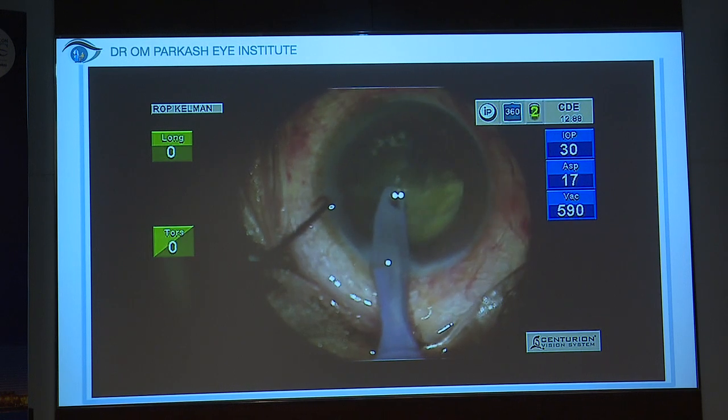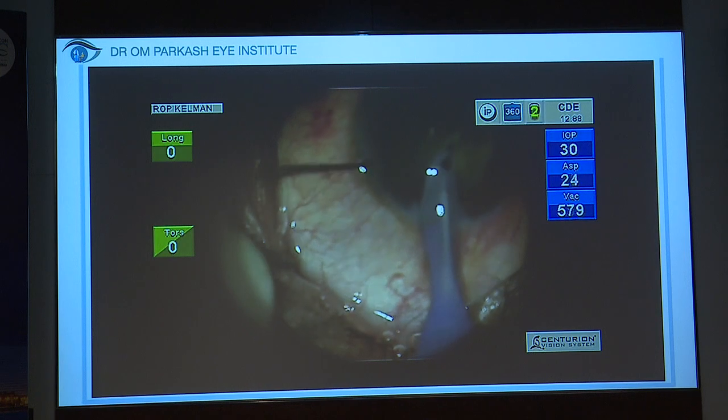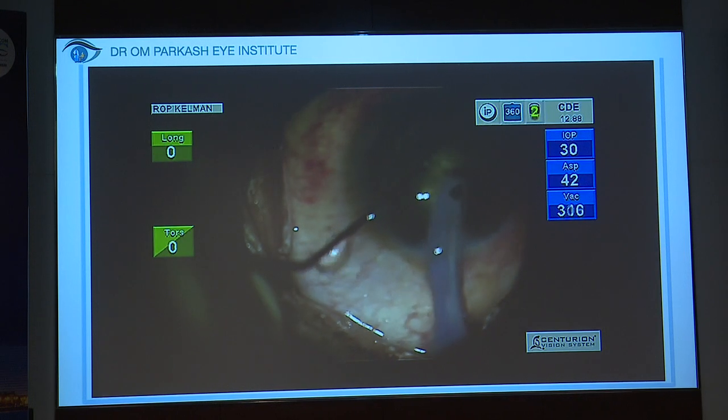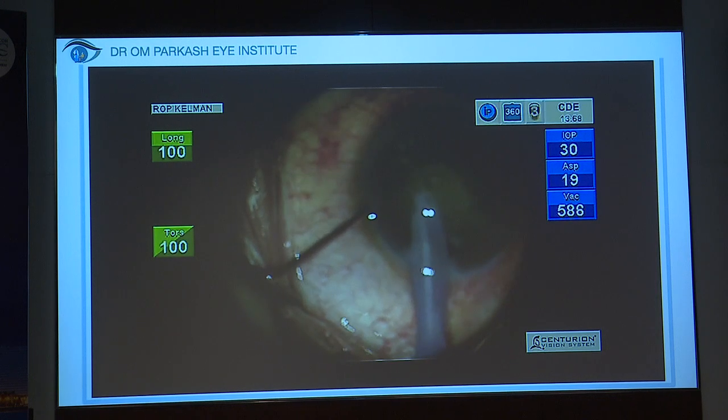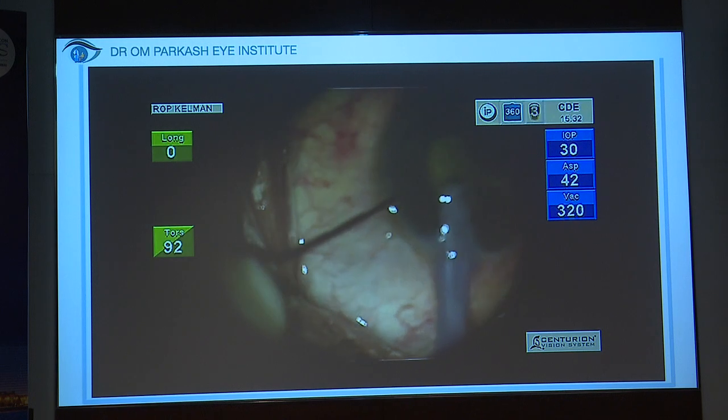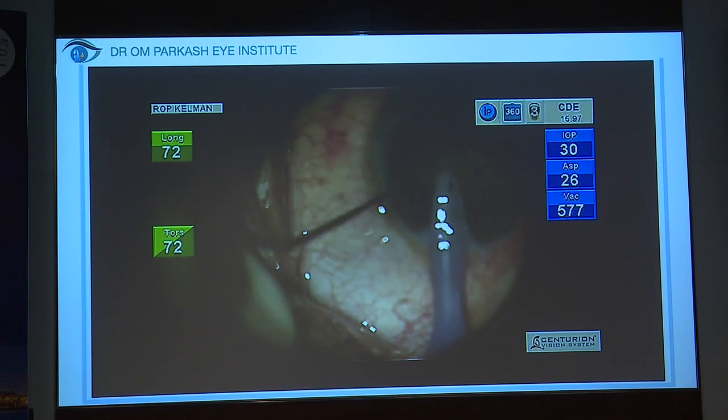So slow motion phacoemulsification should be done, avoiding any nuclear rotation, with low IOP, and as there was a pre-existing PCR, the nucleus was brought into the AC, preventing any extension of the PCR.